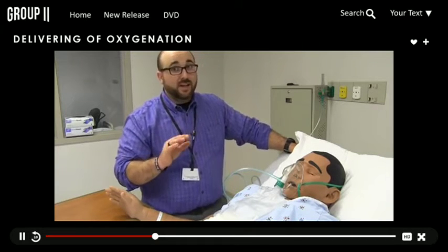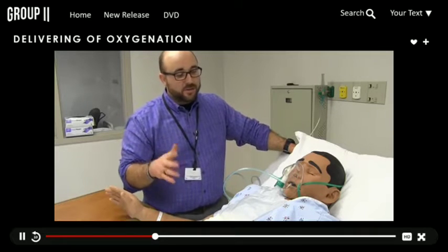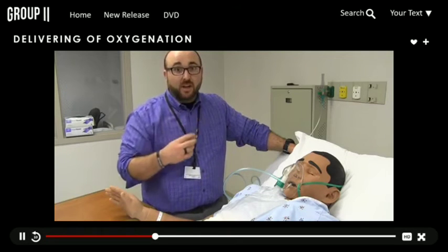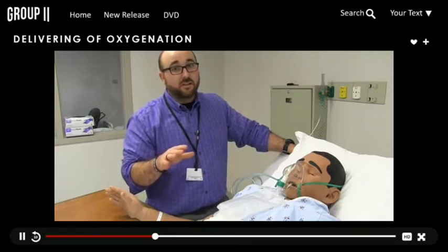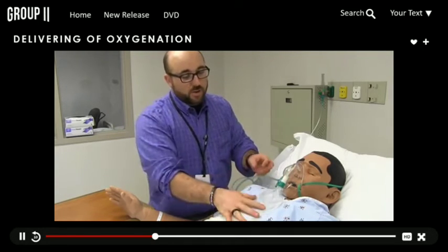For one, you're not delivering much FiO2 at all. And then for two, this is kind of a fun thing. If you're watching soaps with your non-medical partner, the cool thing about the soap operas is this is where you can always catch them on being non-authentic, because every time they put somebody on a non-rebreather on the soaps, it's always deflated.